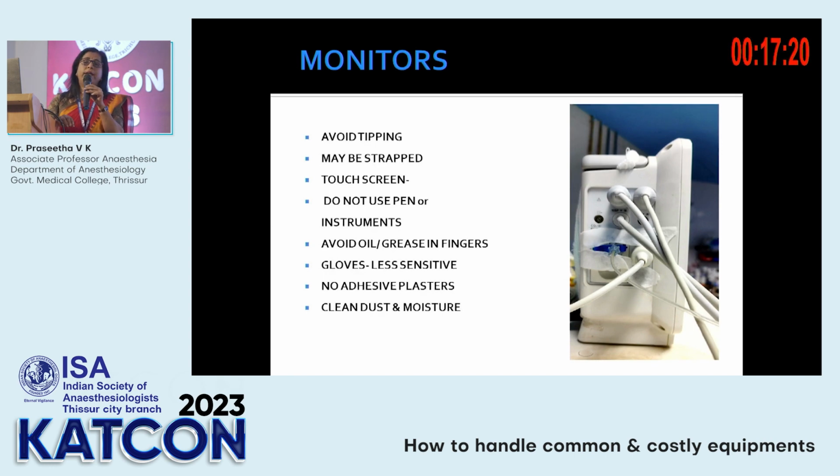And no adhesive plasters on the monitors or the machines, because they will collect dirt in the future. And always after use, you should keep your equipment free of dust and moisture. In the picture on the right hand side, you can see how adhesive plasters have been stuck to make the connections of the monitoring cables tight. This is not advisable.